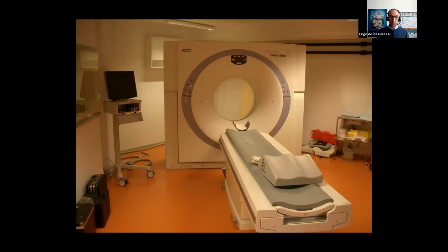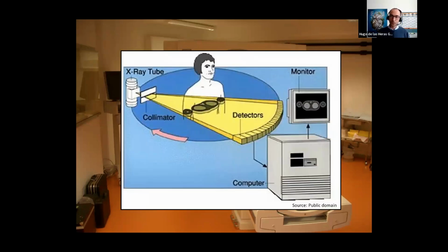One of the issues I wanted you to be familiar with is that CTs have a certain way of dealing with data, called reconstruction. Some of you will be familiar with that and some others not. Inside the CT, an X-ray tube irradiates the patient, and one or several rows of detectors get that radiation. The signals are analyzed in a computer through CT reconstruction, which produces on a monitor the actual image that we're used to seeing from the medical doctors.